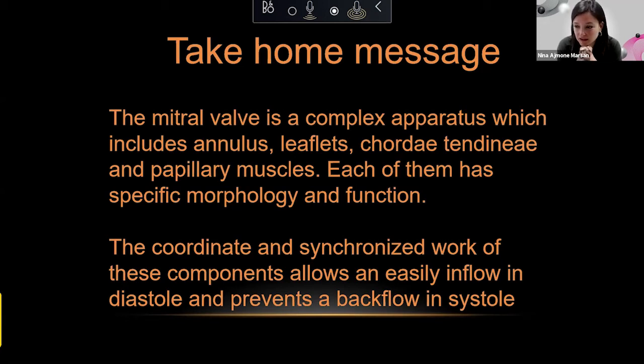You dedicated a lot of your presentation to the annulus, and now there is this concept of mitral annular disjunction that has been associated with ventricular arrhythmias. Do you recognize this phenomenon as a real pathologic one? Some have doubts whether it is actually a variation of normal. What's your opinion about it?